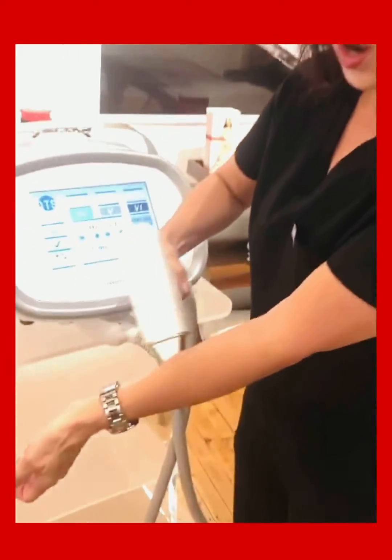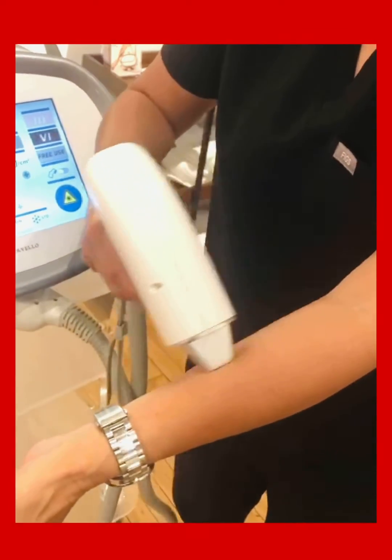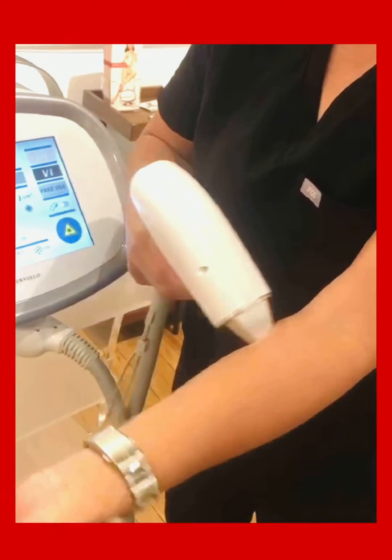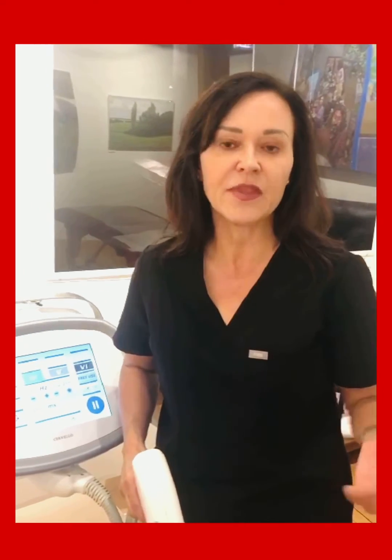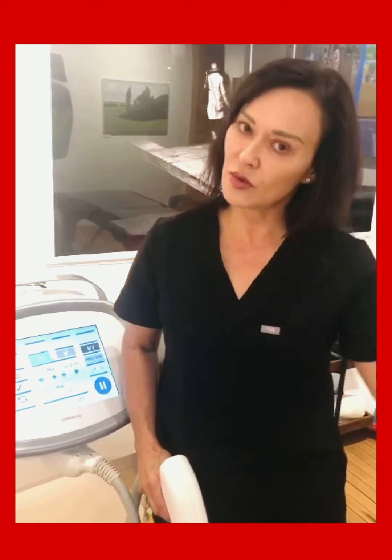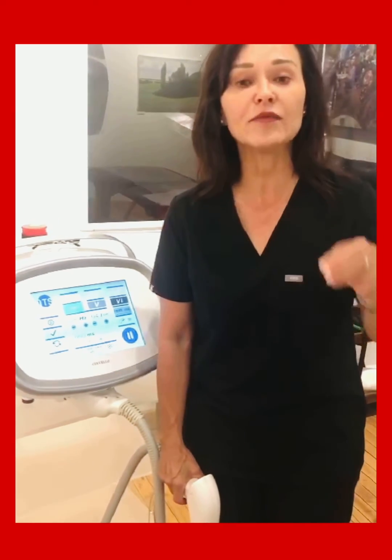I'm going to go ahead and fire in motion. As I'm going back and forth, I'm going to control not only how fast this fires at five pulses per second, but also the rate and speed of my hand. When the patient tells me they feel tugging, pulling, pokiness, or pin pricks, I slow down. After they get off the table, there's no need for blow coolers, numbing cream, or ice. They can go ahead the next day, go on vacation, or even do a spray tan — no other contraindications.